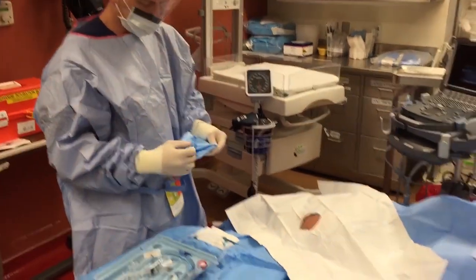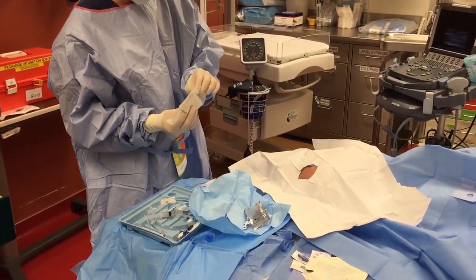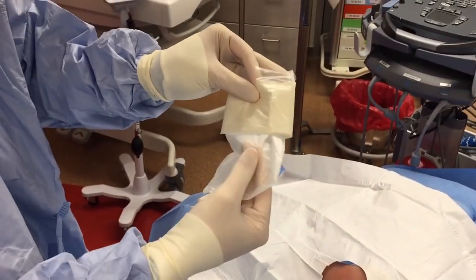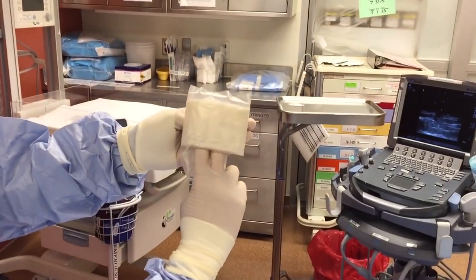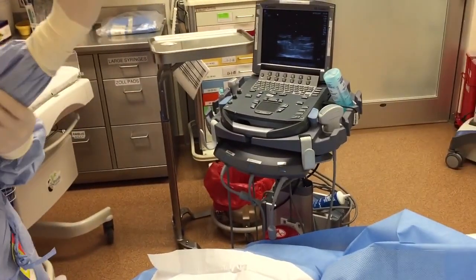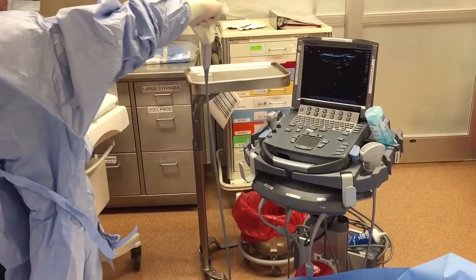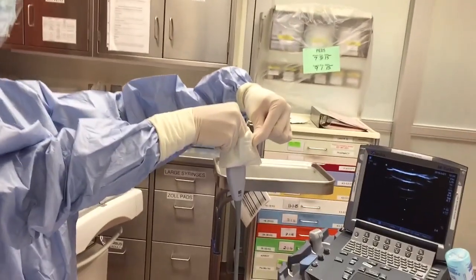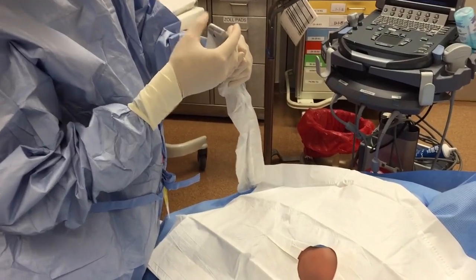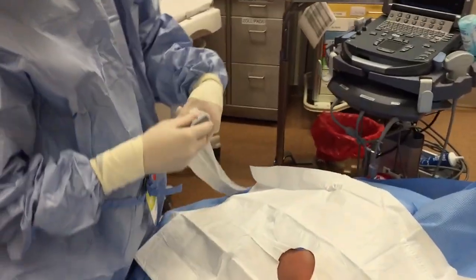The last thing you need to do is get your transducer cover. It has two sides: a side with a little opening and a side with a little tail. You take two fingers on one side of the tail so that it's inside the cuff, and your thumb on the other side — this lets you make a little mouth. That allows you to reach down with your hand totally covered by the sheath, pull up the probe, grab the cuff with your finger, and pull all the way down. Make sure there are no air bubbles, rubber band it, put on some lube, and now you're ready to do the line.